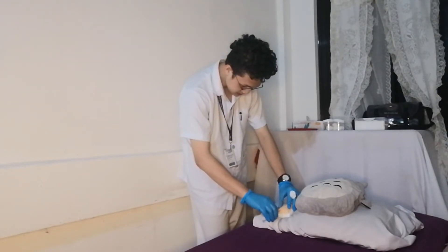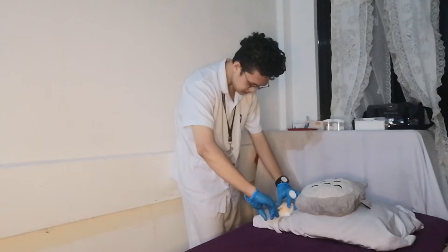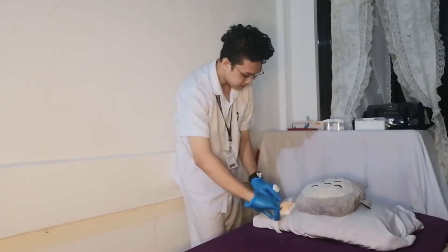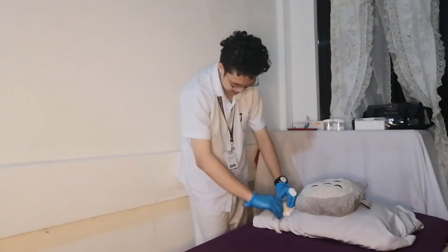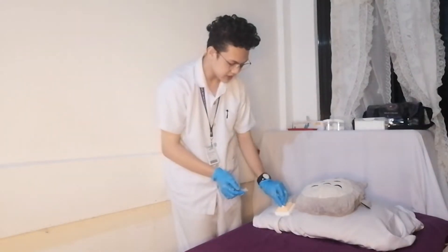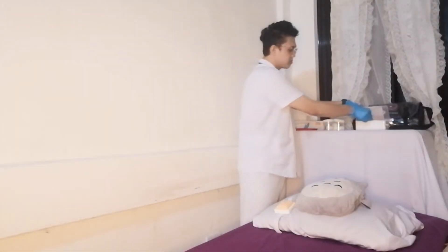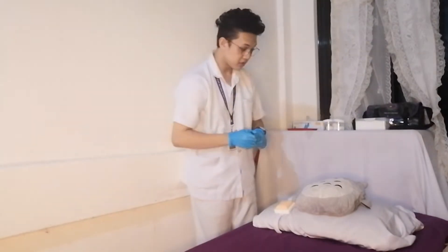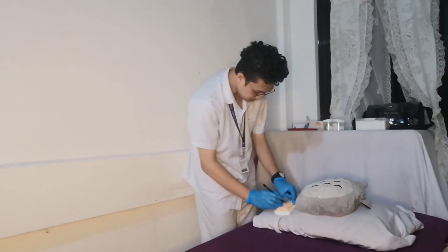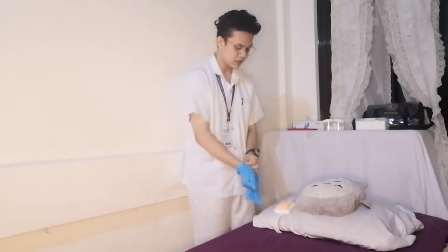I'll be stretching your skin taut to make the entry of the needle easier and more stabilized. I'll be inserting the needle now and advancing the solution. What we see here is what we call the bleb that I told you earlier. I'll be removing the needle and engaging the safety on the needle and syringe. I'll be blot drying the injection site with a dry cotton ball and placing the needle in the proper receptacle. I'll be marking the bleb and I want you to not erase it so that I will be able to locate it later for monitoring.